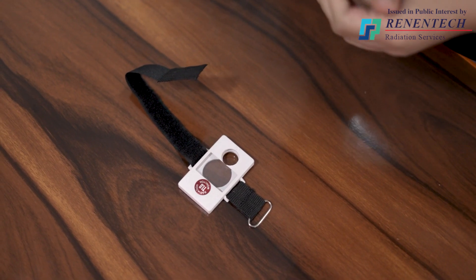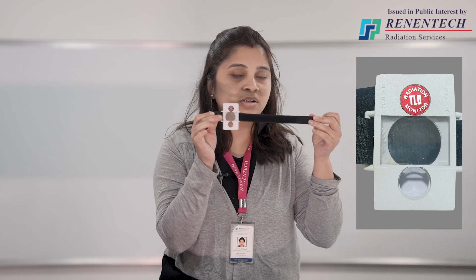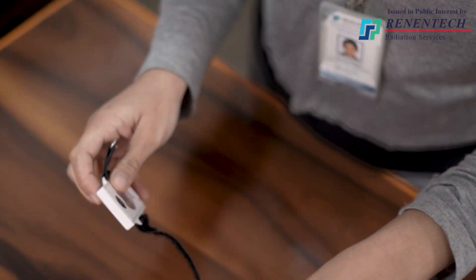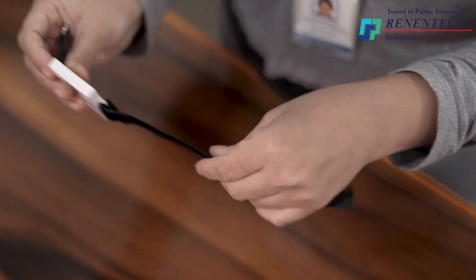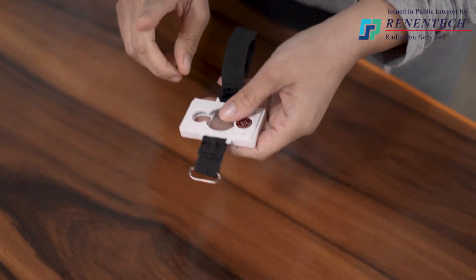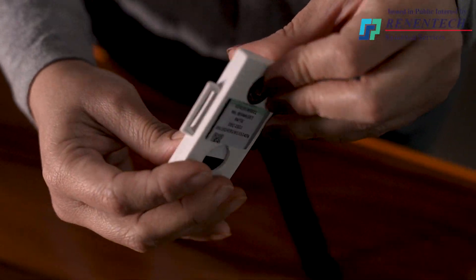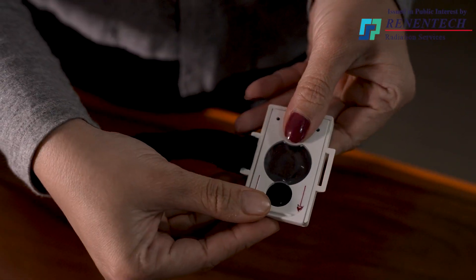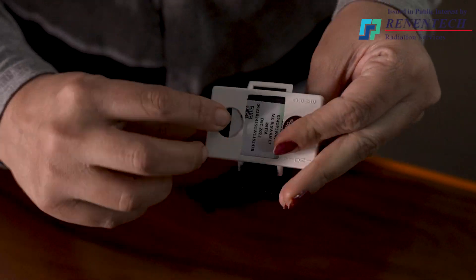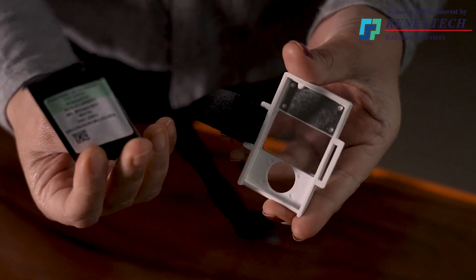In the same way, insert the wrist card into the wrist cassette. This is the wrist cassette — it has a stripe to tie it on the wrist level, which is not present in the chest cassette. To unload the TLD card from the cassette while returning it after expiry of the service period, just move the back cover in the direction of the down arrow, then it will open. Remove the inside card and place the new card which we will be sending you before expiry of the previous service period.